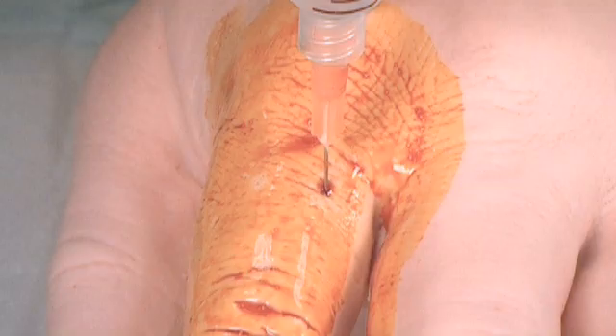This video demonstrates a digital block on a finger. The same principles and technique are used for the toes.